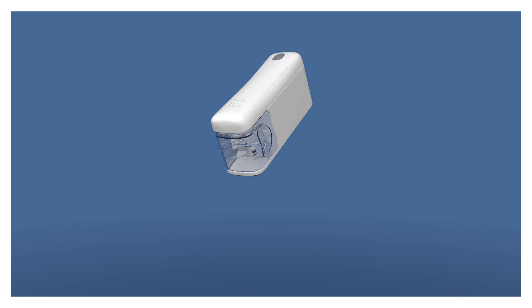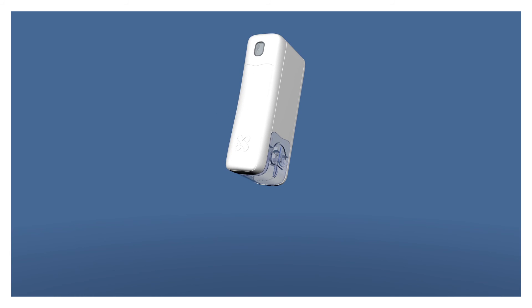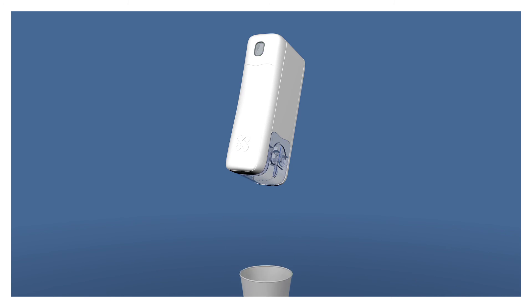When it is time to take the medication, Medimi reminds you with a green flashing light, sound, and vibration. The medications are then fed out with a simple press of a button.